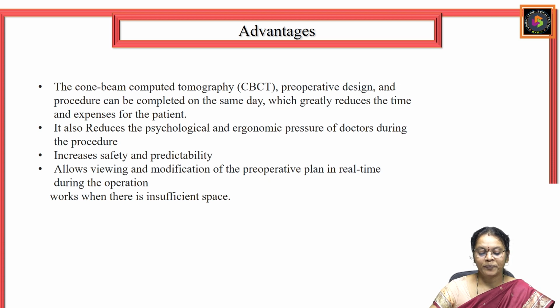It also allows the viewing and modification of the pre-operative plan in real time when the operation is going on live.